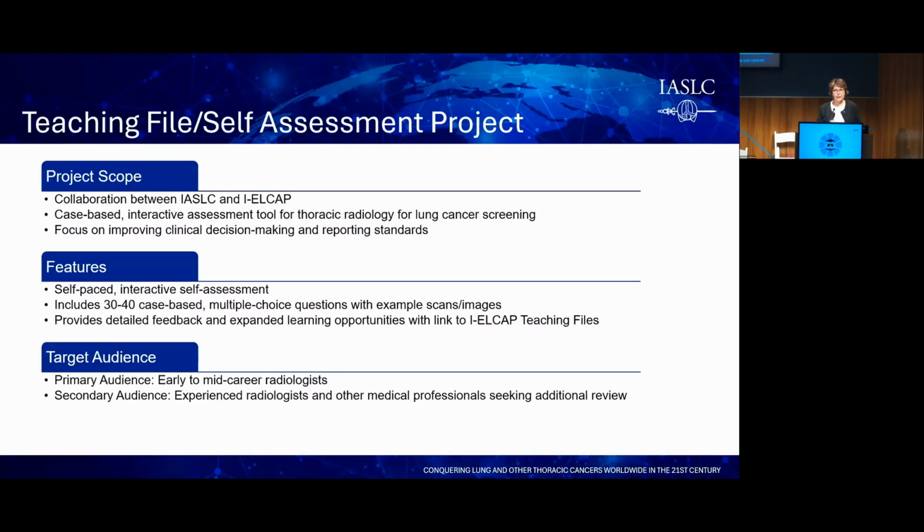So the next step is now the development of a teaching file self-assessment project. This is in collaboration with the IASLC, and it is a case-based interactive assessment tool, and mainly the purpose of it is to train particularly new readers for lung cancer screening using a standardized protocol.